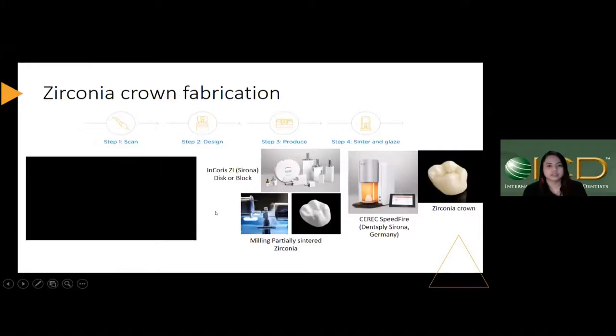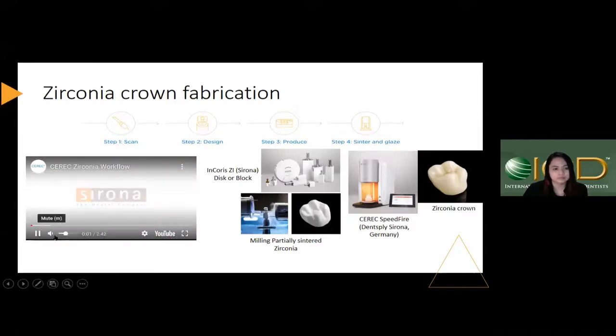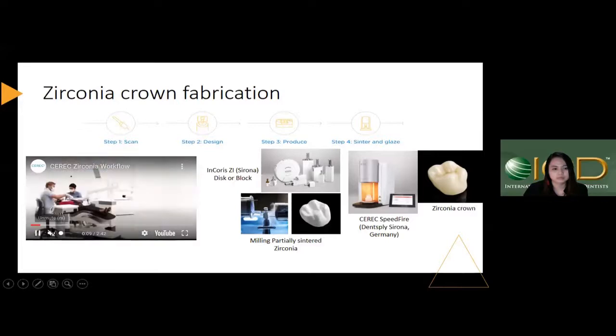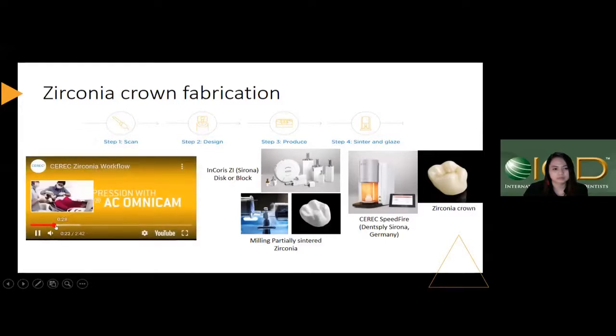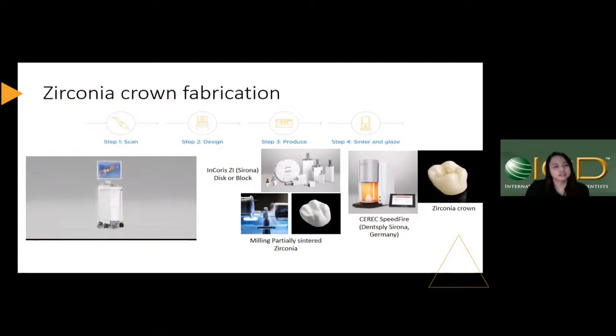Now I'd like to give some examples and the steps that we need to fabricate zirconia crowns. This video shows chairside zirconia fabrication from the CEREC system. First, we scan the site.